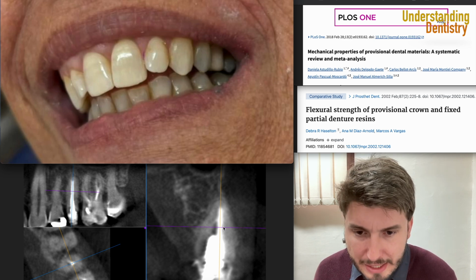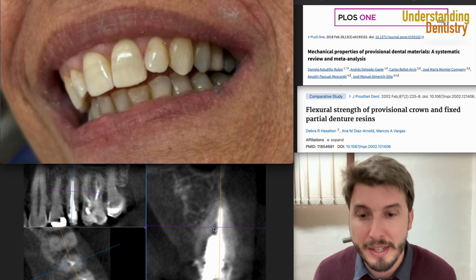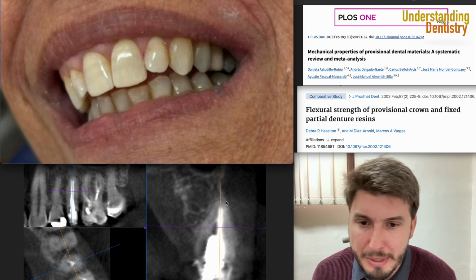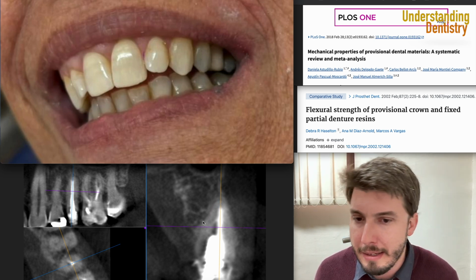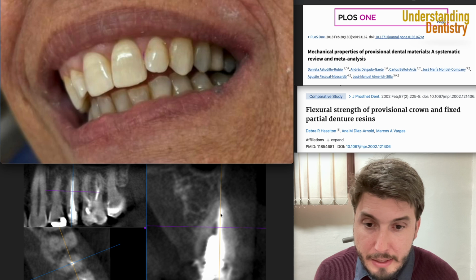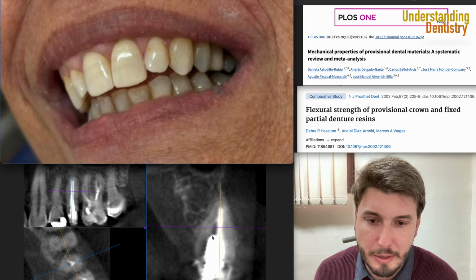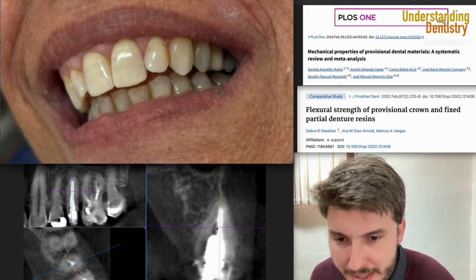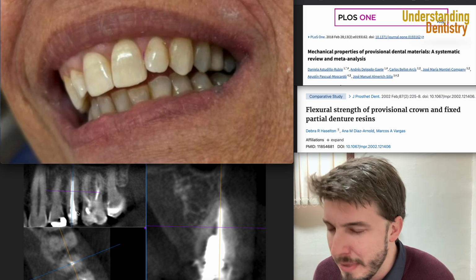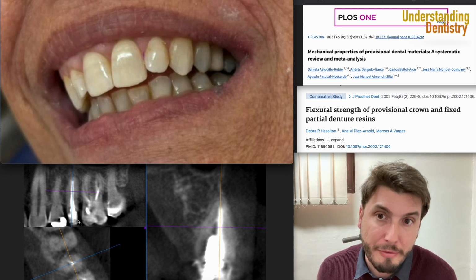And now we can take advantage of the CBCT to make sure that there are no fractures or cracks on this root, okay? So we do have the root canal treatments nicely here, maybe a little bit underextended, but of course no lesions. The periodontal ligament space is all seen here in the cross-sectional plane. And then we have here the root canal treatment and all this area with a radiopaque material packed here in the pulp chamber. This is not exactly a crown, maybe a preparation with a restoration. At least there are some shapes of a crown already existing here.